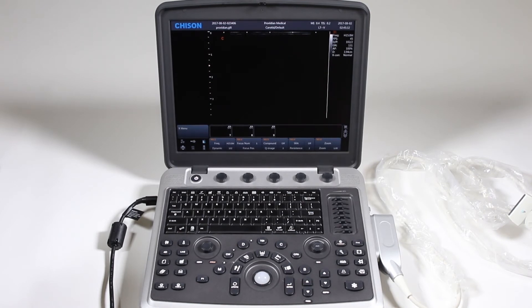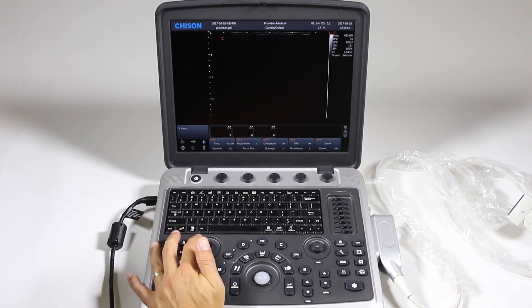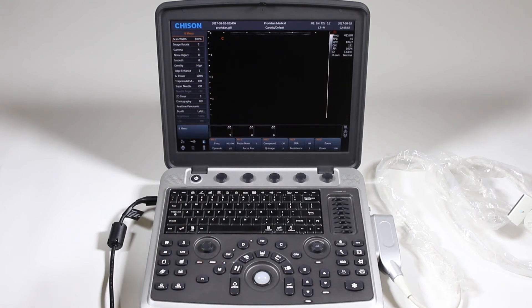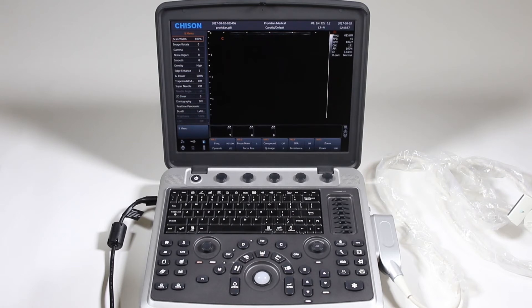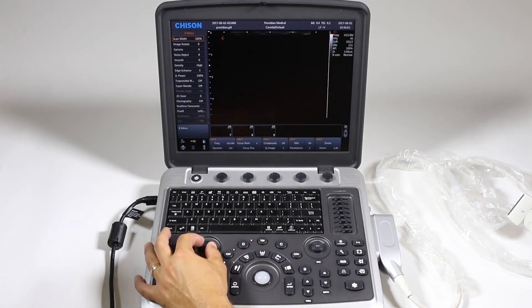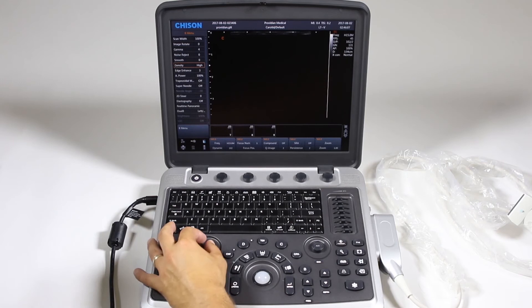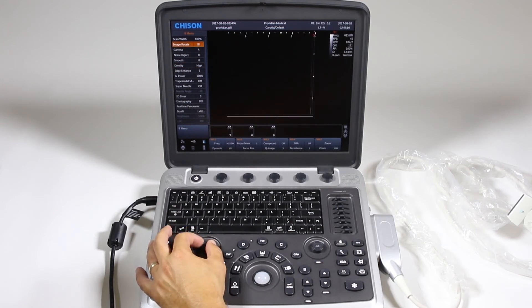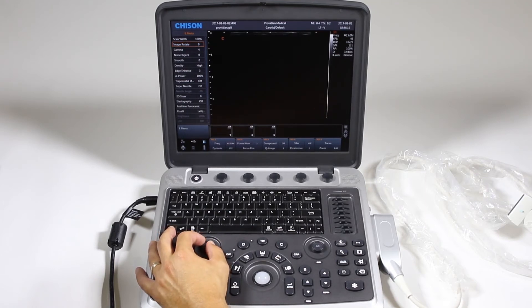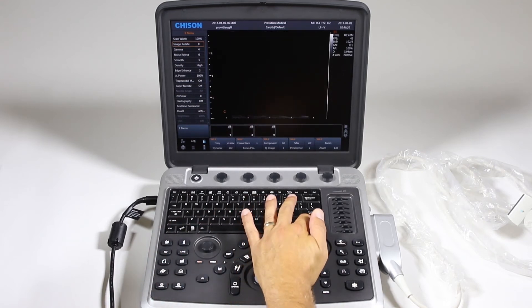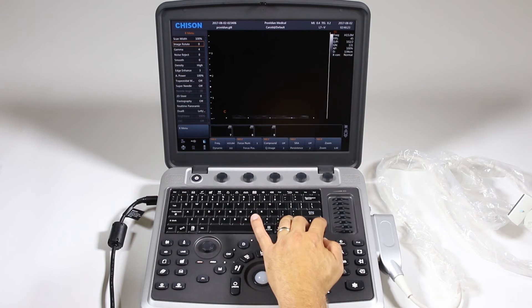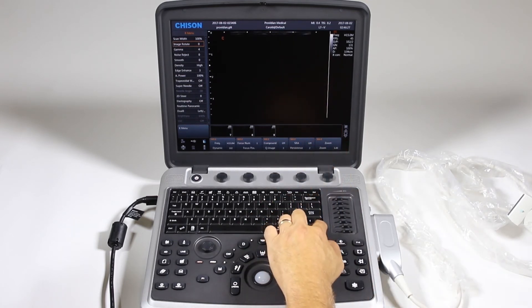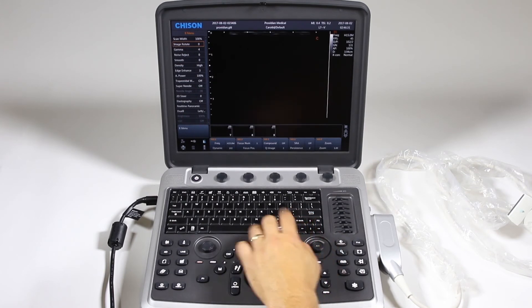Now we discussed many of these other functions in the previous video. Let's get into more 2D imaging items. Earlier we showed, press this menu down and you get a whole new set. And this set is also function dependent, depending on which modality you're in. You know, carotid, like if you're doing vascular or OBGYN, these menus will change. So you have up top your scan width and how you adjust this menu is you twist. This menu knob and you'll see how it highlights and changes. And if you want to go, you can flip through here and change that. Now I just rotated the image. There is another hidden feature here. If you want to flip your image upside down, it's up and down arrow, left and right arrow to reverse the image side. So you can just click up, down, left, right, or just hit the same one back and forth.